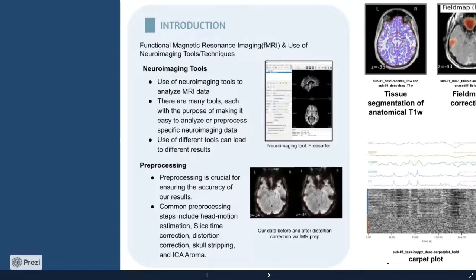Pre-processing makes data easier to interpret and use. Pre-processing pipelines eliminate inconsistencies or noise in data, which can otherwise negatively affect a model's accuracy. The pre-processing step is crucial for ensuring the validity of our results. We use the fMRIPrep pre-processing tool because it equips us with a high-quality, robust, easy to use and transparent pre-processing workflow. fMRIPrep requires minimal user input while providing easily interpretable and comprehensive outputs.